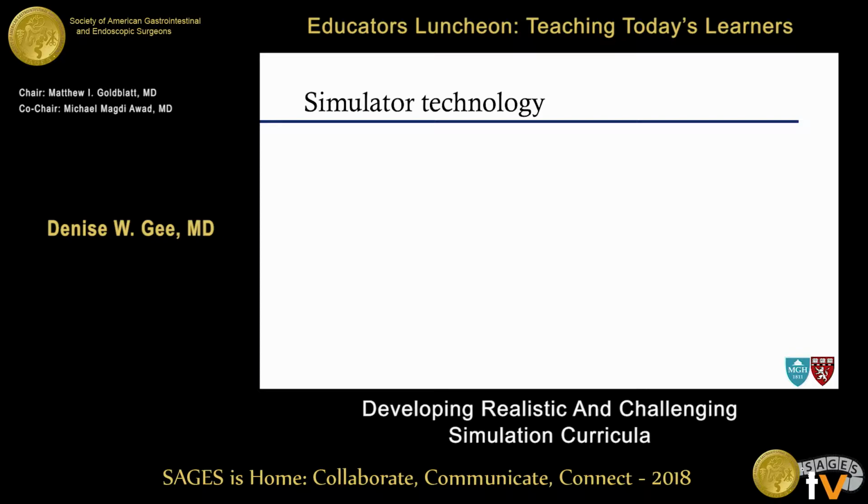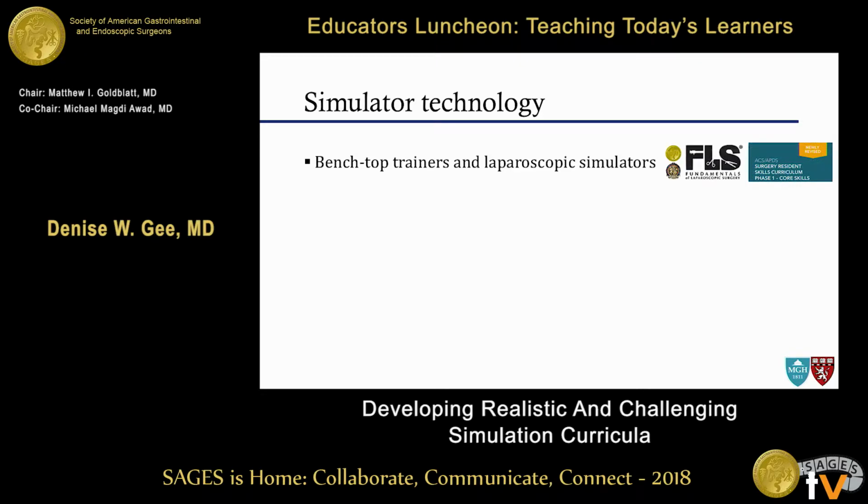And when you talk about realistic and challenging, a lot of times people start thinking about simulators and what the most cutting edge, greatest technology simulators are. And so I thought I would review kind of what's available as far as simulator technology. So it starts off with the most common, benchtop and laparoscopic trainers. This is what FLS is based upon, as well as the ACS, APDS Phase 1 core skills.